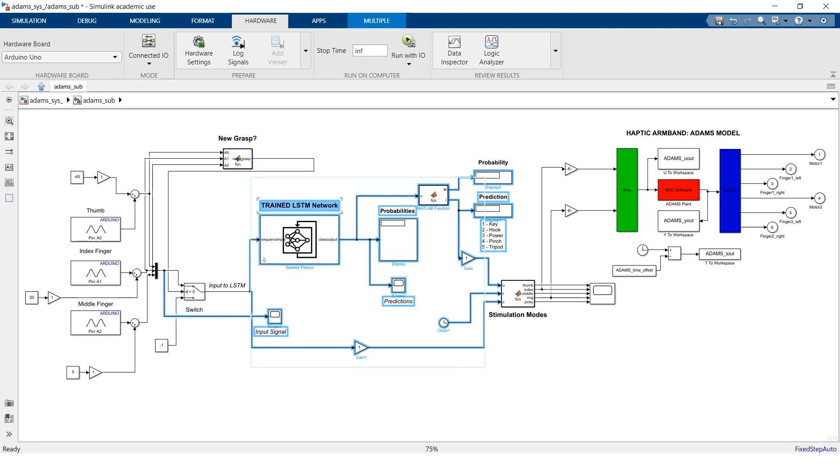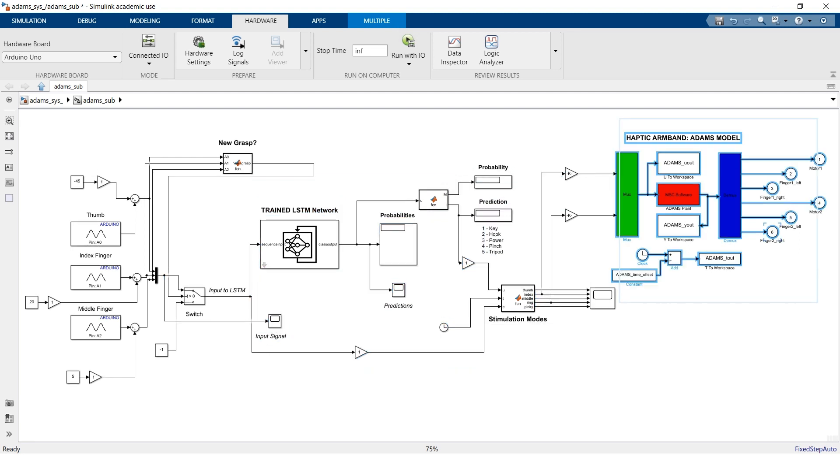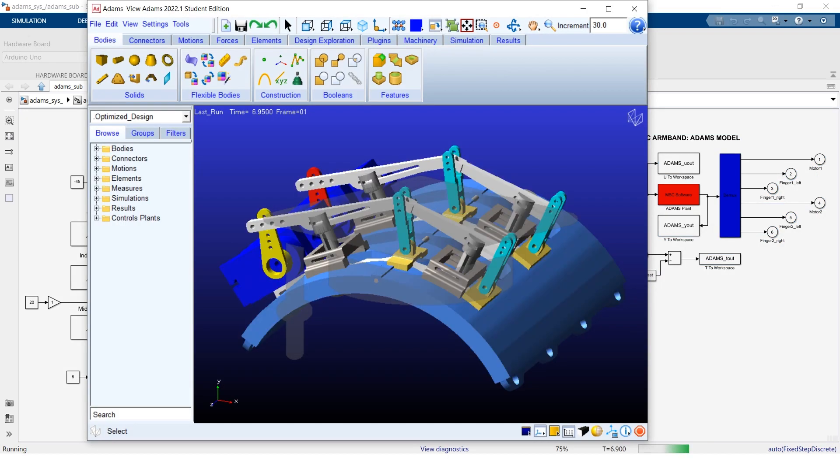The LSTM network itself is making continuous predictions. Once we have a confident prediction we produce a stimulation mode using this MATLAB function and then we send it to an Adams model of the haptic handband.